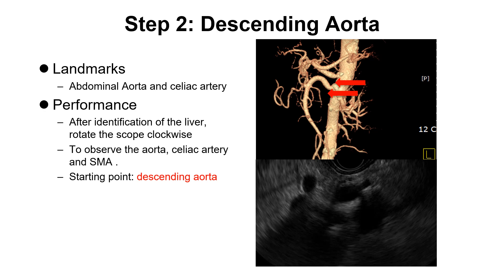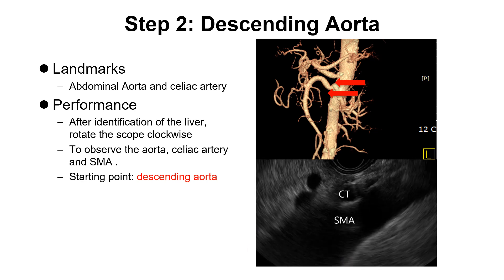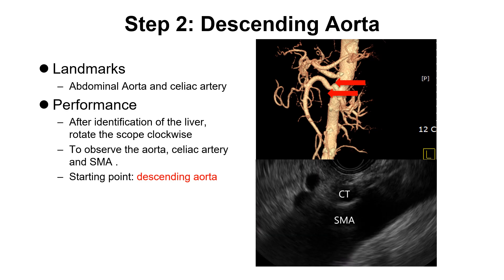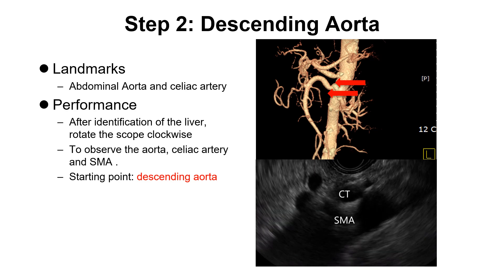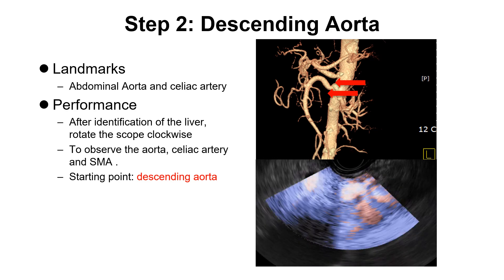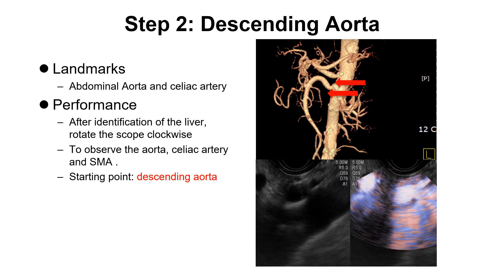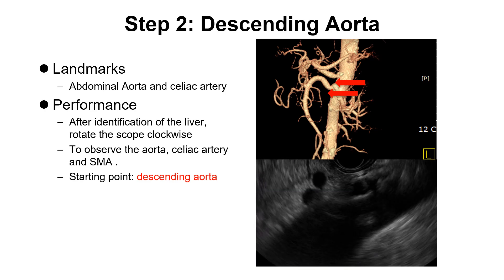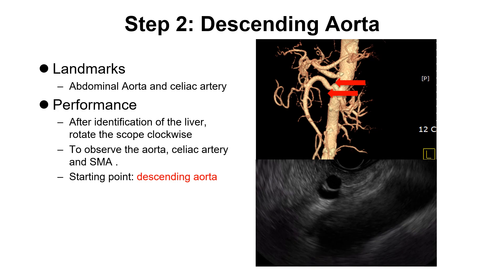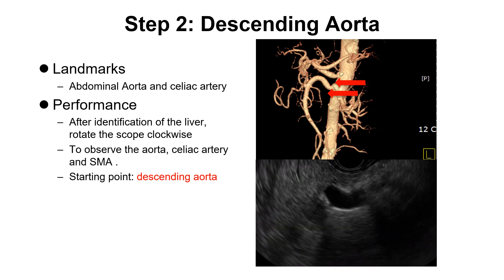Step 2: Descending aorta — that is a great home base. The celiac trunk and SMA take off from the descending aorta. On EUS video clips, we can see the descending aorta, and the celiac trunk and SMA take off. Following the celiac trunk, we can see the splenic artery and hepatic artery.